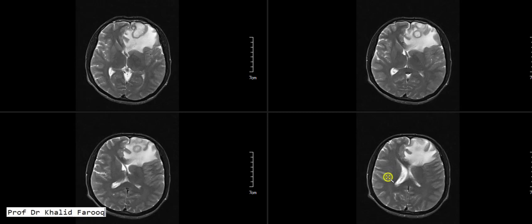Bismillahirrahmanirrahim, assalamu alaikum warahmatullah. We are discussing MRI of the brain. This patient has presented with high-grade fever. This is an axial T2 weighted sequence and we can see abnormal signals in the left frontal lobe.